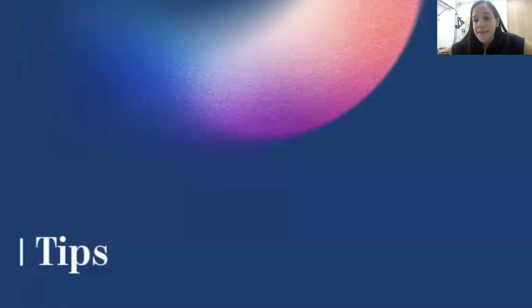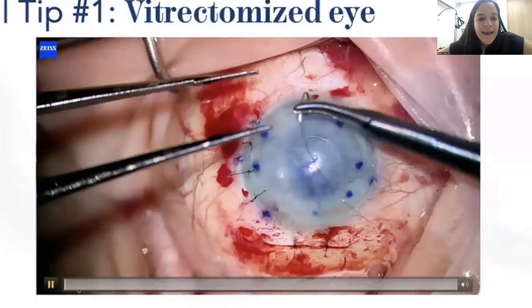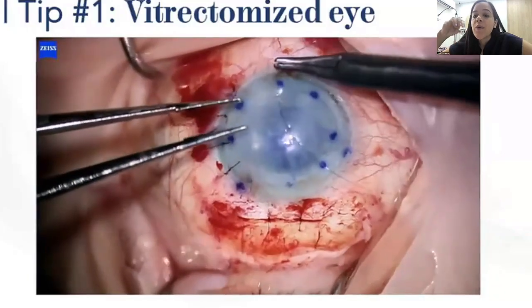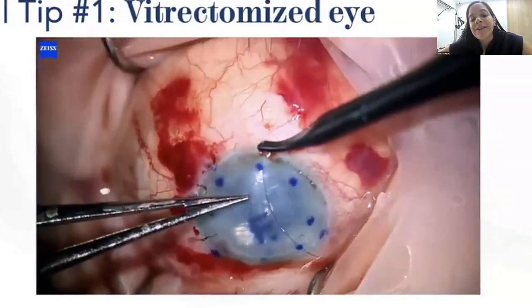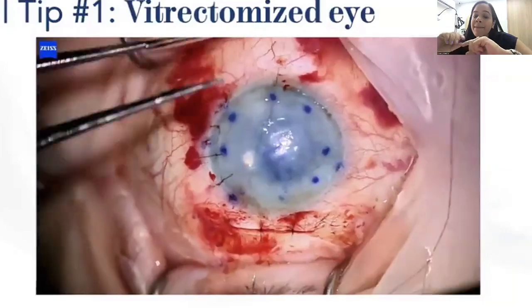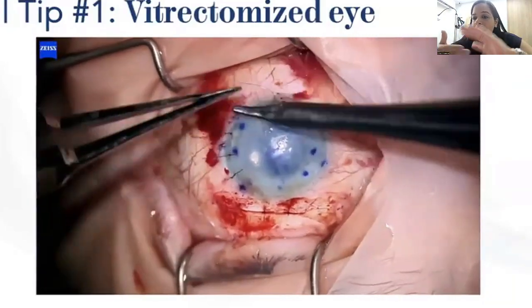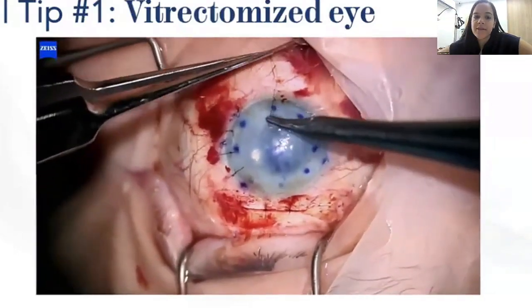So I will now show some tips that I learned. The first one: when you have a vitrectomized eye, the bubble goes to the posterior chamber, so we have to make sure that the graft stays in place. What we do is place a superior suture that will hold our graft there. If there's a detachment of the graft, it will hold with that suture, and you just have to rebubble in the office.